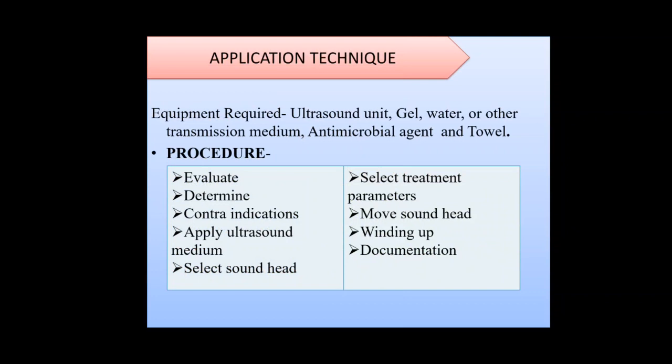So the first stage is to evaluate. First you should evaluate the patient's clinical findings. You should be able to identify the patient's problem and condition appropriately, and then set the goal for the treatment. You should select the goal, whether you want the thermal effect of the ultrasound or you want the non-thermal effect of the ultrasound. Again, that is based on the condition of the patient.